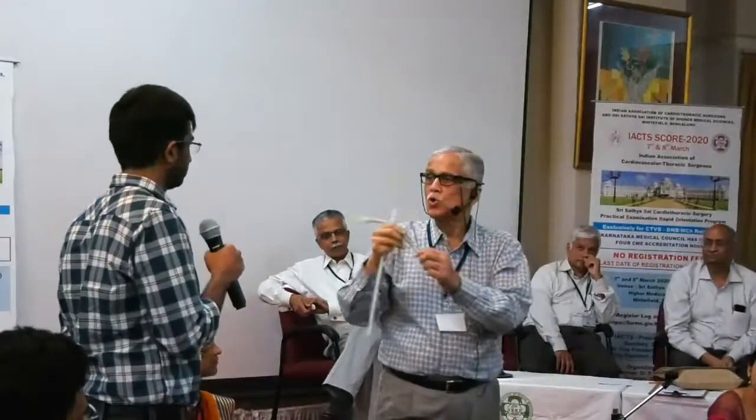So simple question, which are the two stages? This is for IVC drainage and this is for drainage of the RA. What he says, in the RA, for drainage of the RA. So it is used on the beating heart. The other name of this cannula is the cavo-atrial cannula.